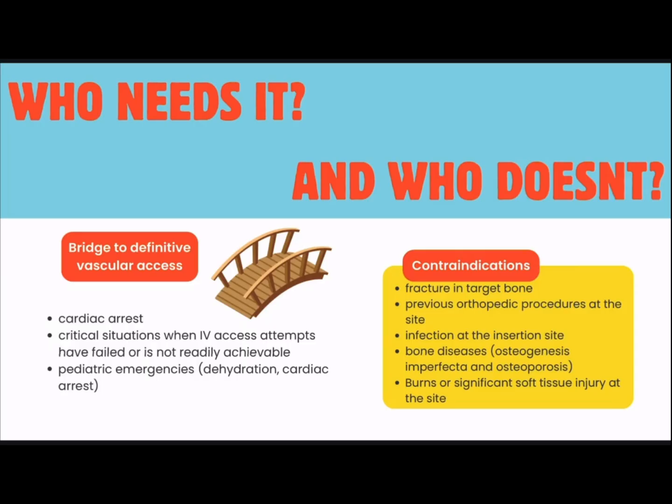So that's going to move us to the next bullet point here, infection at the insertion site. We really don't want to put a needle through infected tissue because this increases the risk of spreading infection to the bone, causing osteomyelitis. How do we know the patient has a local infection? You're going to see some redness, some swelling, maybe some warmth on that tissue, maybe even leaking if there's an open sore of some sort. The other thing is if the patient's conscious and can tell you, they might have extreme pain or lots of pain at that site.